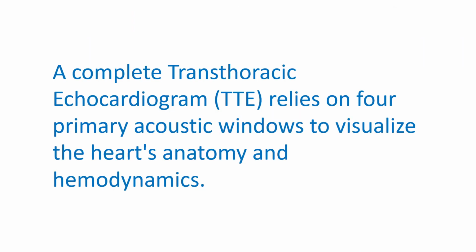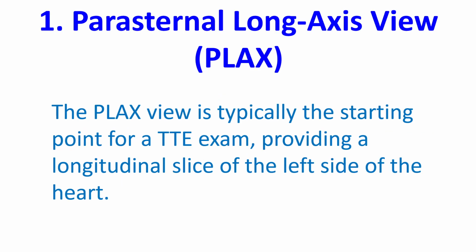A complete transthoracic echocardiogram relies on four primary acoustic windows to visualize the heart's anatomy and hemodynamics. Parasternal long-axis view, often called the PLAX view, is typically the starting point for a transthoracic examination, providing a longitudinal slice of the left side of the heart.